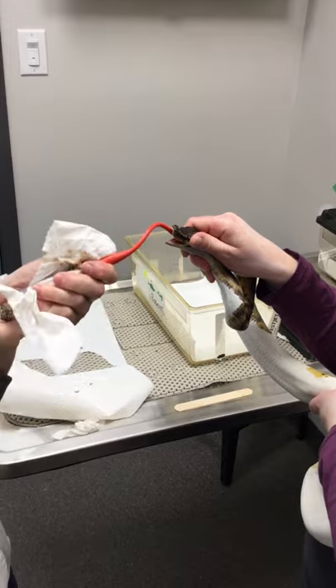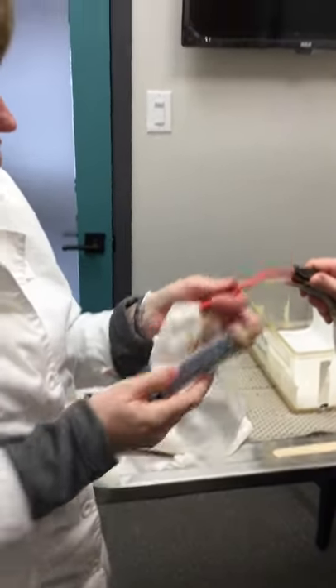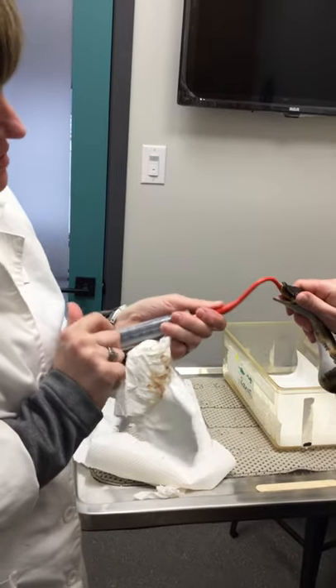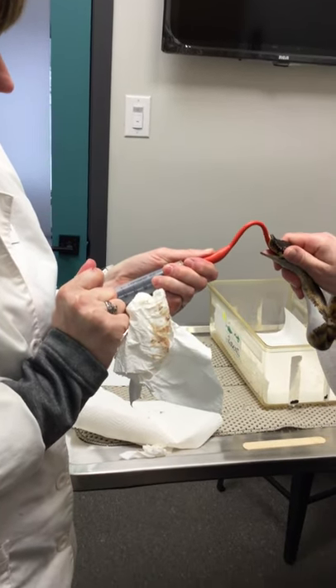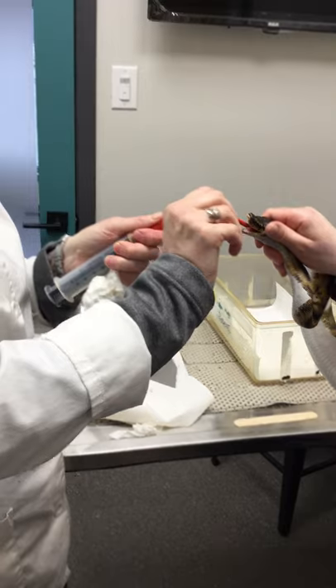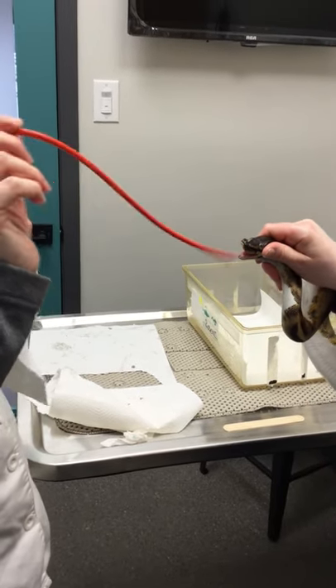At the end, if there's a teeny bit left in the tube, pull up a teeny bit of air and push that through the tube — you'll typically hear a little pop as the food goes out of the tube and into the snake. Then pull the tube straight out and you're done.